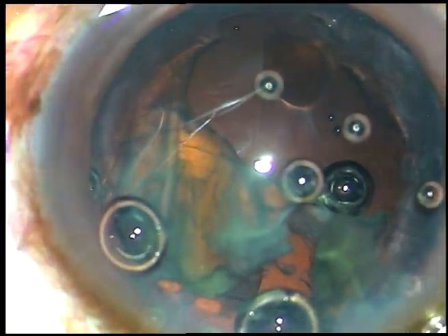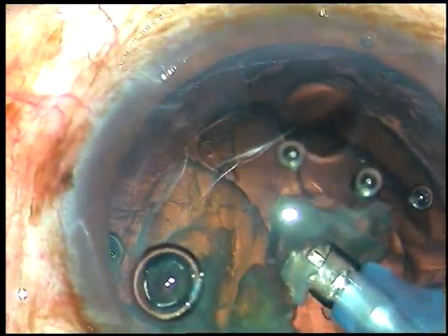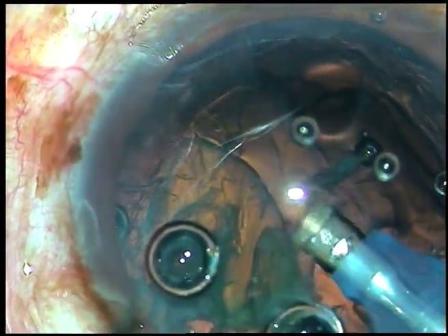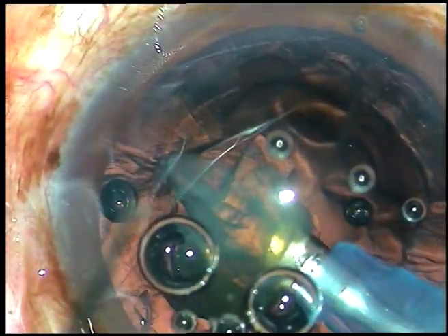Viscoat is nice — it can be injected through the side port by the left hand. Now I am managing the rest of the nucleus. I have lowered the bottle height a little bit and slowly I am emulsifying the nuclear fragments.